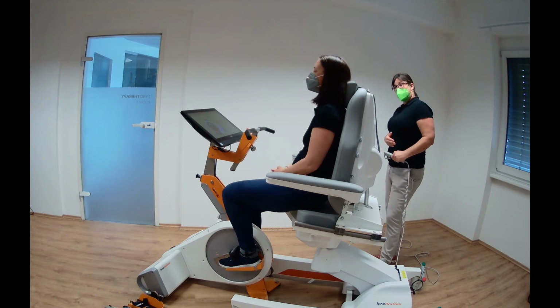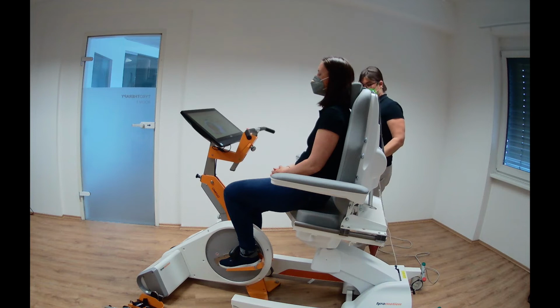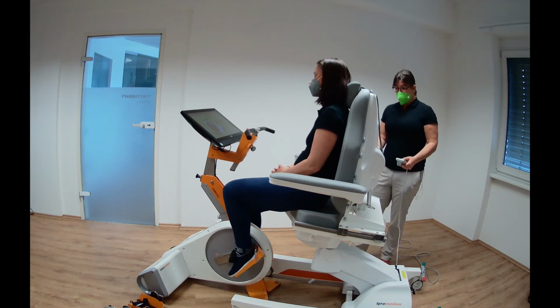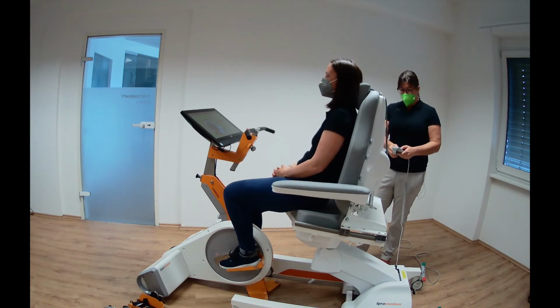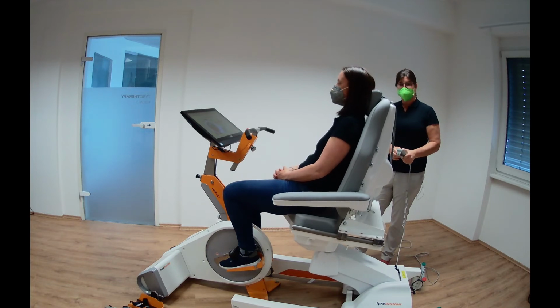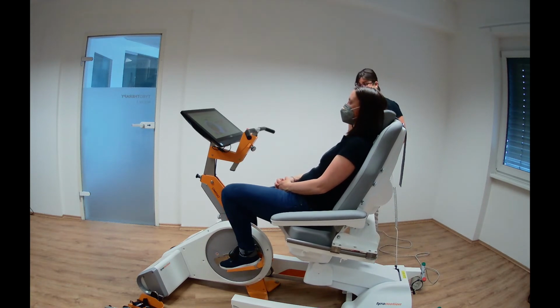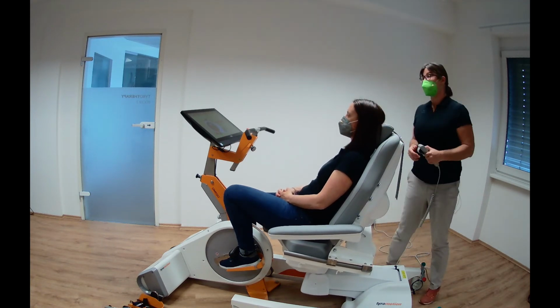So here we have the same situation. You can adjust the position however you want. You can let her do the leg press in the same position we had before, but you can also lower her a little bit, for example. And most of you might know the leg press from the gym. And in the gym, we are in an almost lying position.